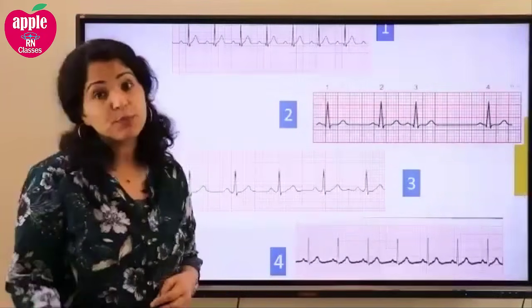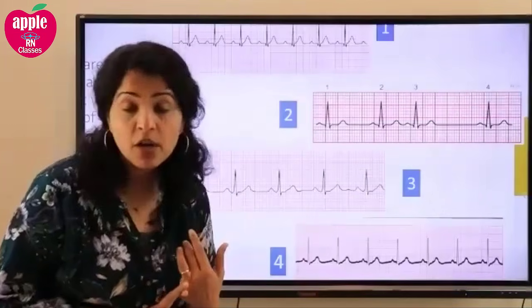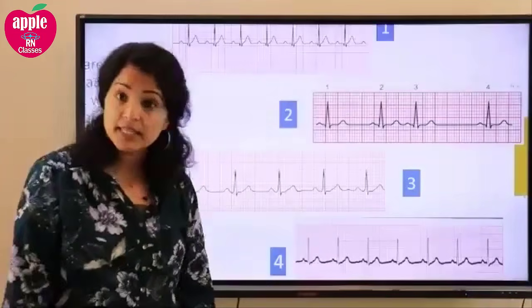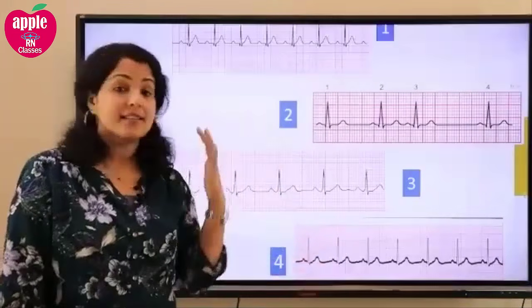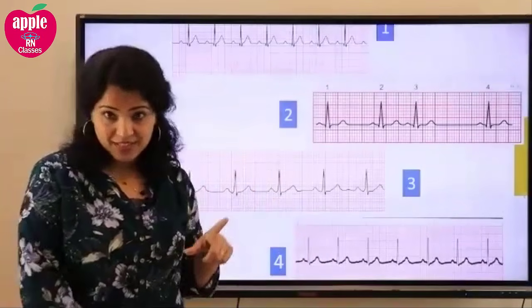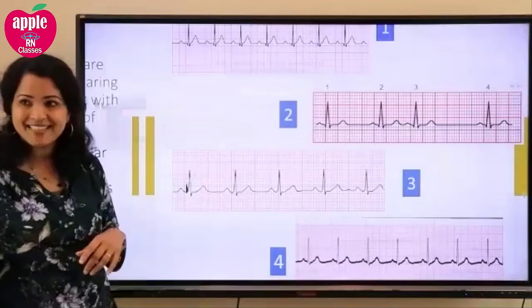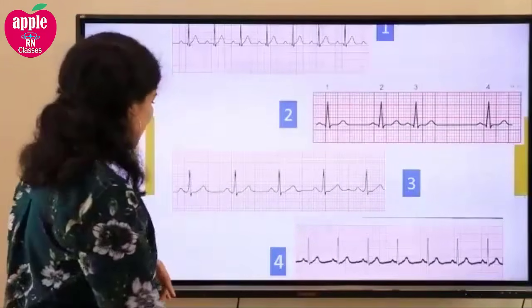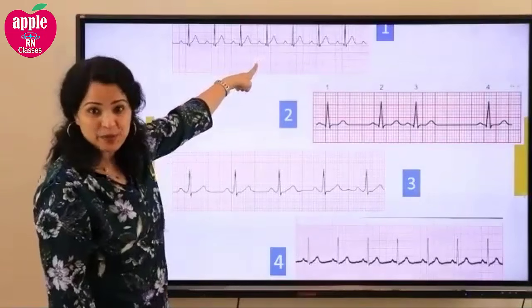Remember, the husband was late, but he was coming every day. I mean, he was supposed to come at 5, but now every day he is coming at 6 p.m. But he is there. Every night he is there. He's late, but he is there. That is first degree. Right? Very good, very good. Now I'm seeing some good answers there. So the answer is this one, or number 1.